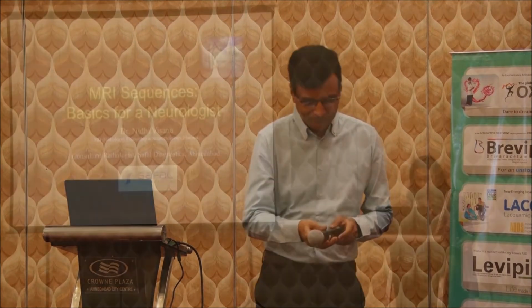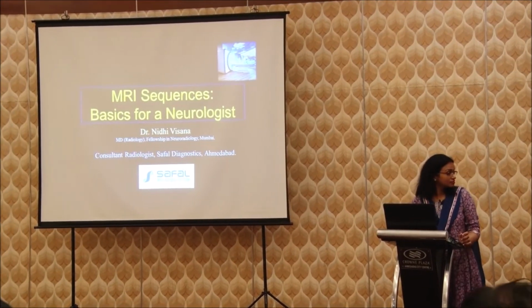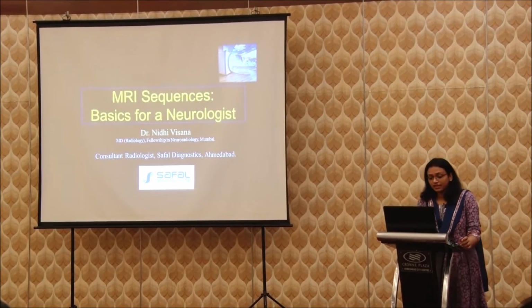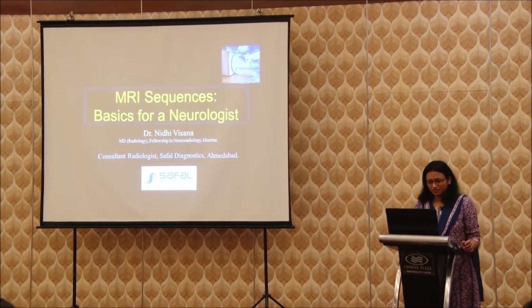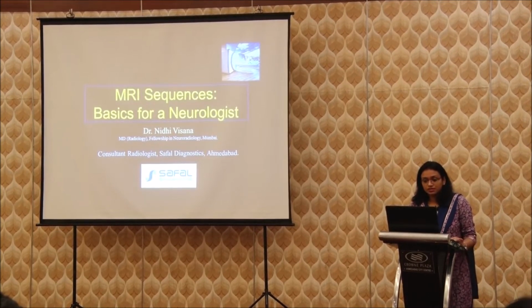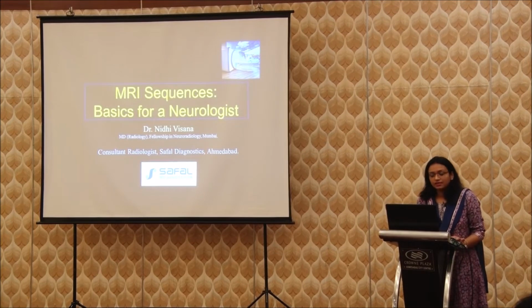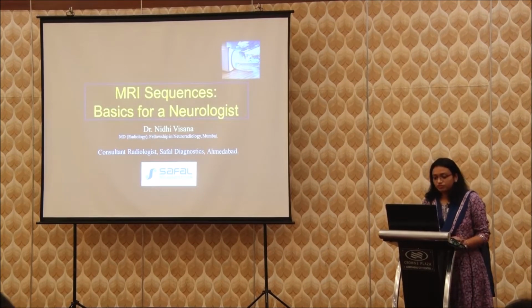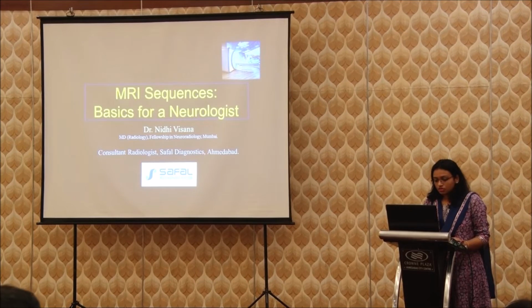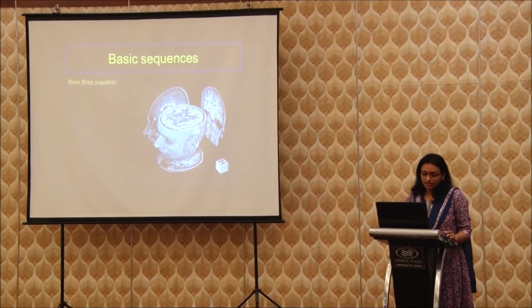Thank you. A very good morning to all. I am Dr. Nidhi, and I am here to talk about the first topic for today, which is MRI sequences. I'm sure most of us know about the MRI sequences, and this might be just a revision for most of you. There are over 100 sequences which have been described in MRI.